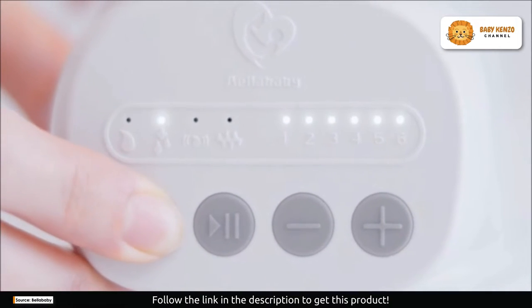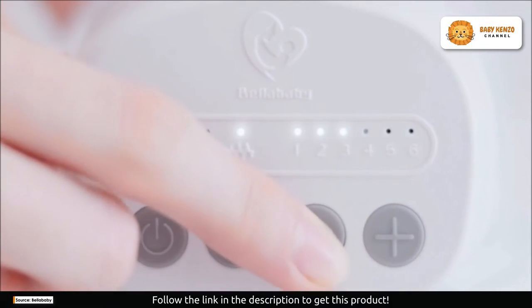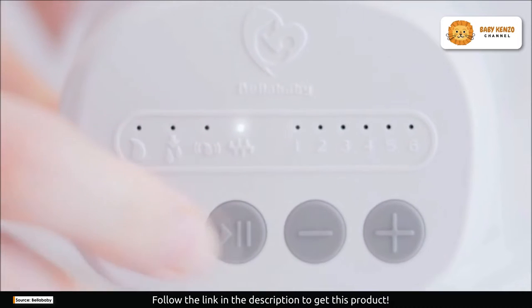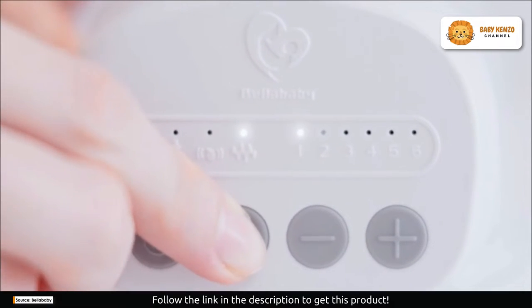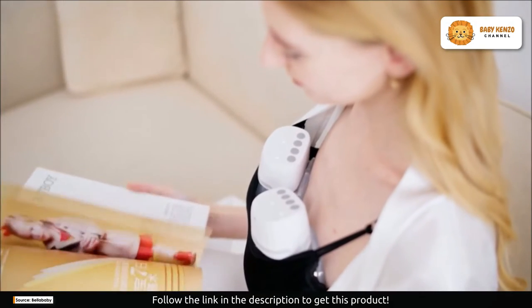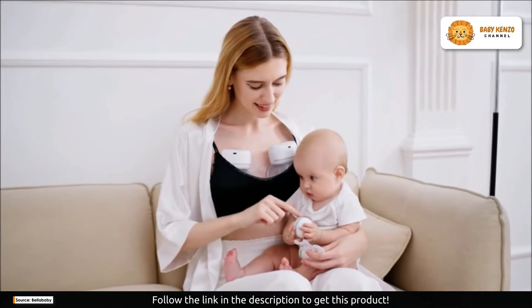Are you tired of being tied down while pumping? The Bellababy W42 is your solution. It's compact, lightweight, and most importantly, wearable. Imagine starting your pumping session without any cords, tubes, or dangling bottles. With a generous 6-ounce capacity, this pump is designed to give you the freedom you've been craving.